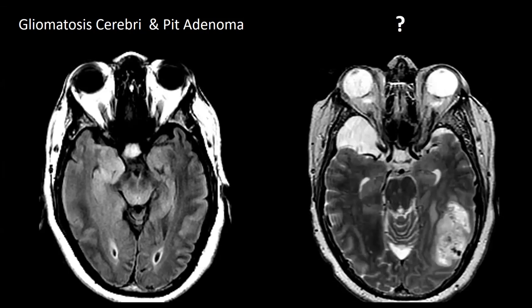All right, we'll try this one, kind of a variation. Arachnoid cyst of the right temporal pole, which is the single most common location. And that turned out to be a glioblastoma in the left temporal lobe. What's the common theme so far in all of these two diseases? The common theme is that everything I'm showing you is common. They are among the most common diseases or findings. You don't have to call an arachnoid cyst a disease; that's just an incidental finding. Statistically, it's most likely that a patient might have two of the most common. So far I haven't shown you a really rare thing, but those do occur as well, a rare with a common. Two really rare occurring together, the odds are way against that. Sure, it can happen, but statistically very uncommon.